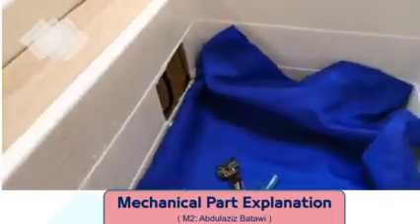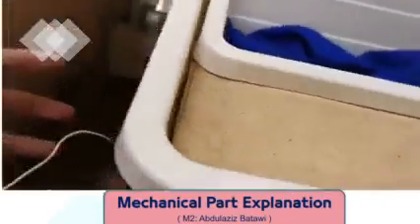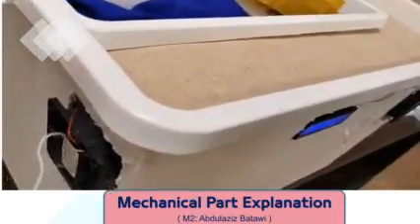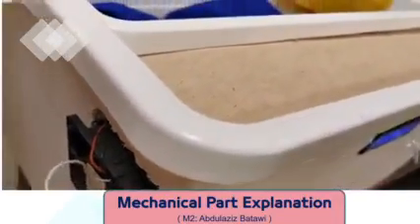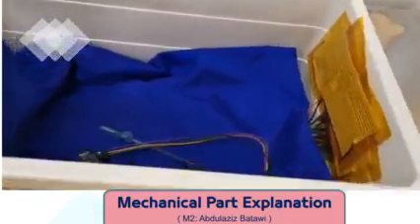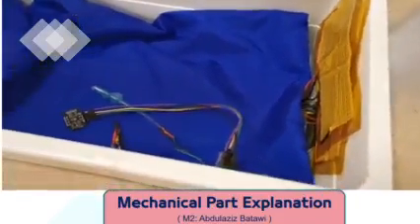Then finally we have a fan that, as you can see, sucks out the air, so we have an air circulation within our incubator. Then we also have the heaters, which will also be carried through this pathway.